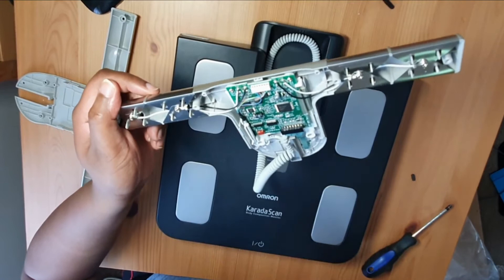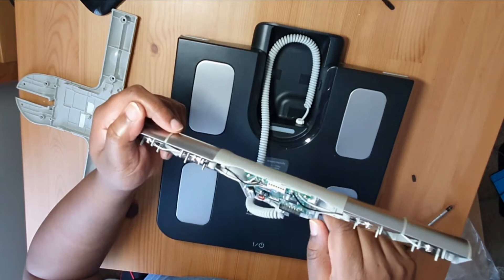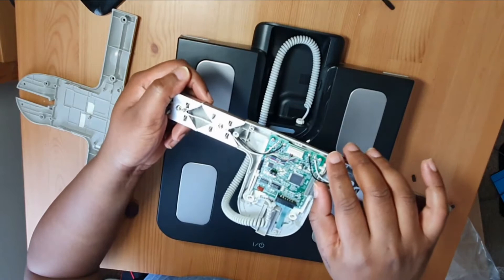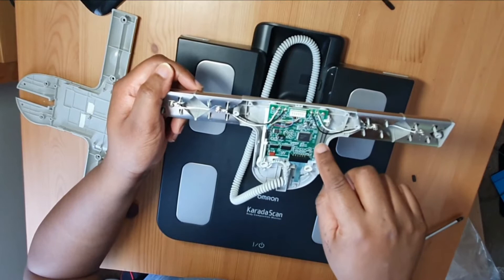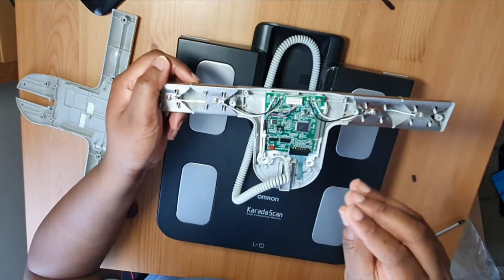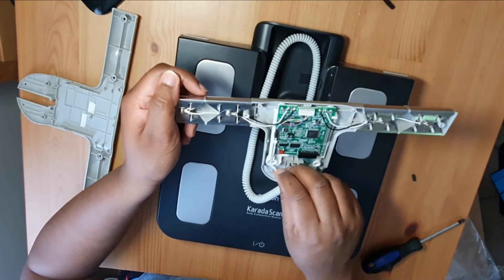So it'll display the load sensors, the load cells, which will all come to the display looked after by this ribbon here. The ribbon looks absolutely fine — in fairness everything on this board looks absolutely immaculate. What I want to do is just unscrew this board so I can turn it over and see if just by putting some pressure between the contacts and the pads of the LCD the problem goes away. I'm not sure if it will, but let's give it a try. First thing we'll do is just unhook this.